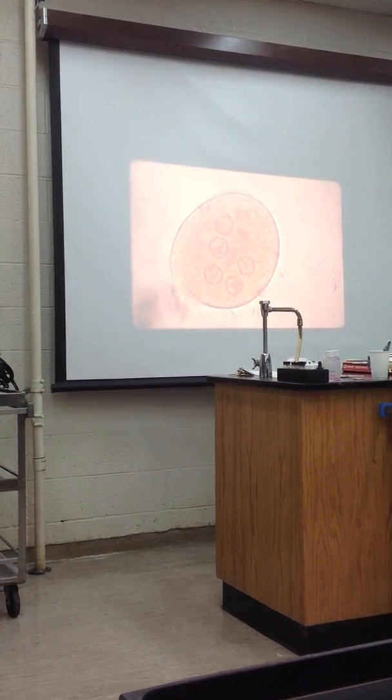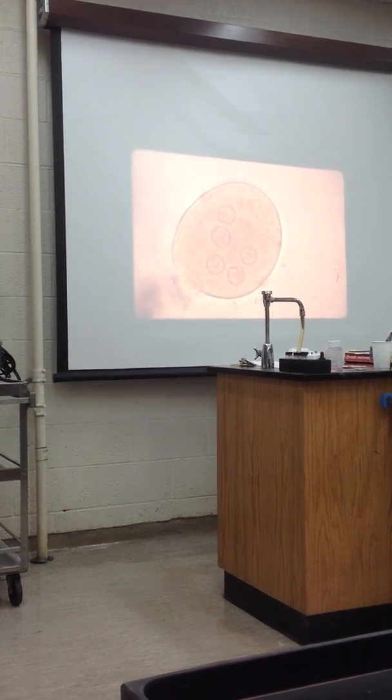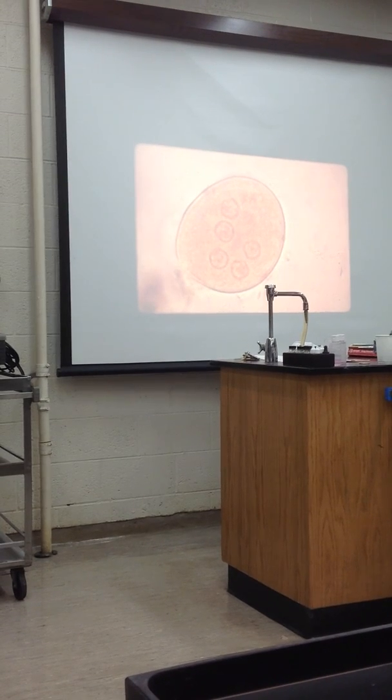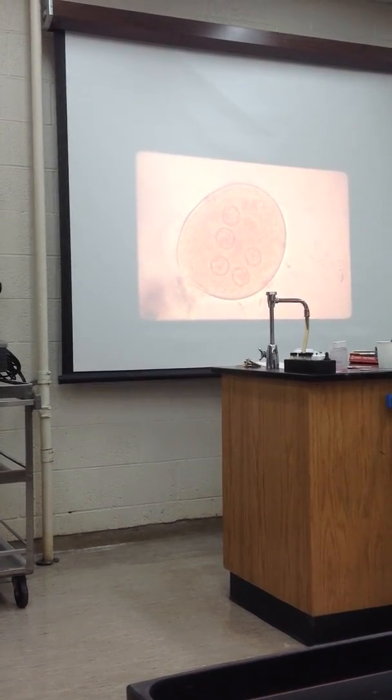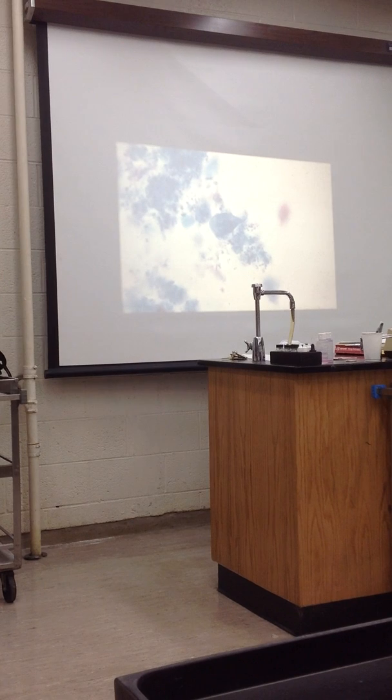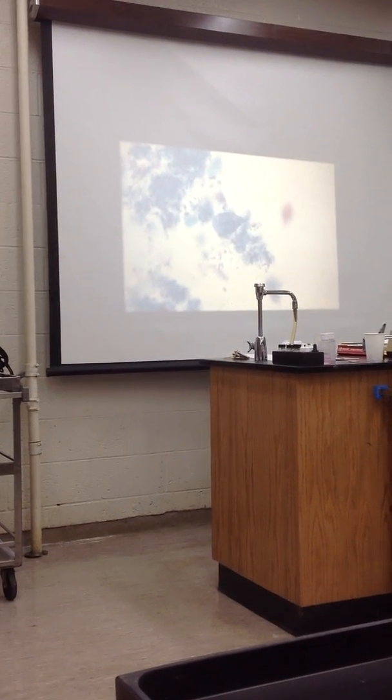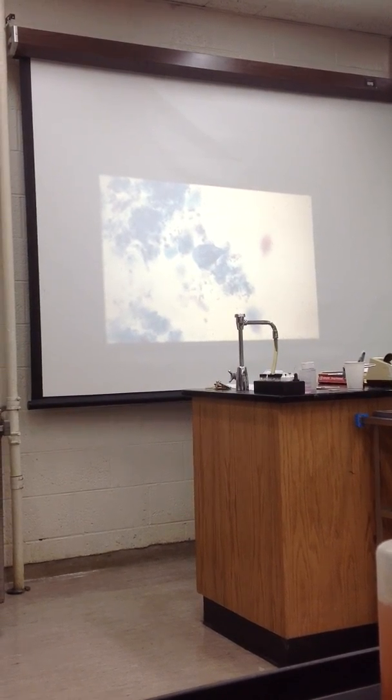Entamoeba histolytica. That is the cyst form of Entamoeba histolytica. So, Ms. Perez, can you identify that organism for me? Giardia lamblia. How do I make the diagnosis? It causes malabsorption. I didn't ask that. How do I make the diagnosis?